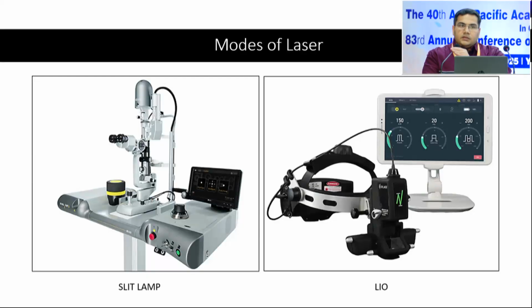So as discussed by previous speakers, there are two modes of laser delivery. One is slit lamp, which is ergonomically better both for the patient and for the doctor. And one is LIO for the more peripheral lesions.